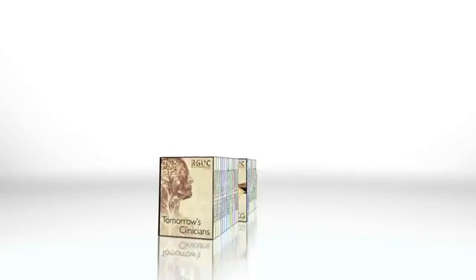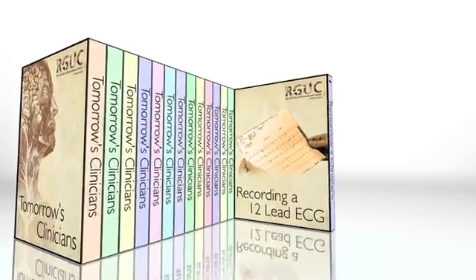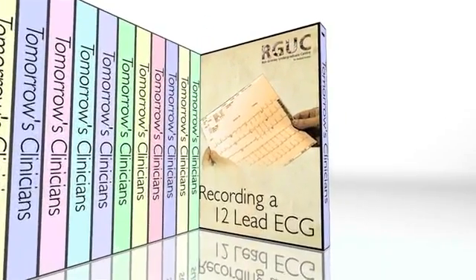In this episode of Tomorrow's Clinicians, we will be looking at the procedure of recording a 12-lead ECG. An electrocardiogram or ECG is performed to assess the rhythm and electrical activity of the heart.